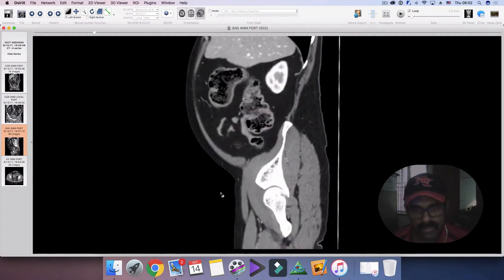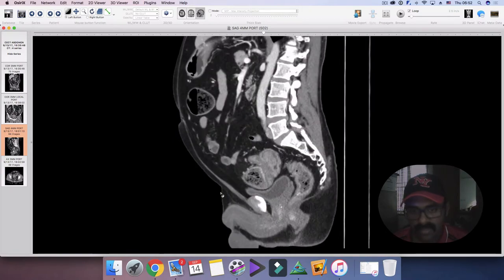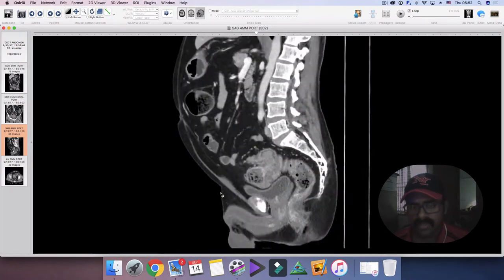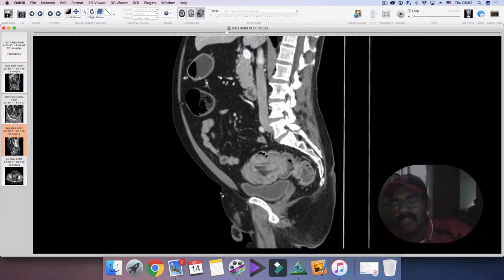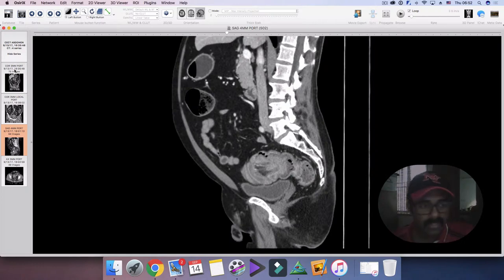Looking at the sagittal images of the same findings: a patient who presents with colicky intermittent abdominal pain, frank obstruction, and features of bilious vomiting — you're thinking of large bowel obstruction. And this is an example of such a case.